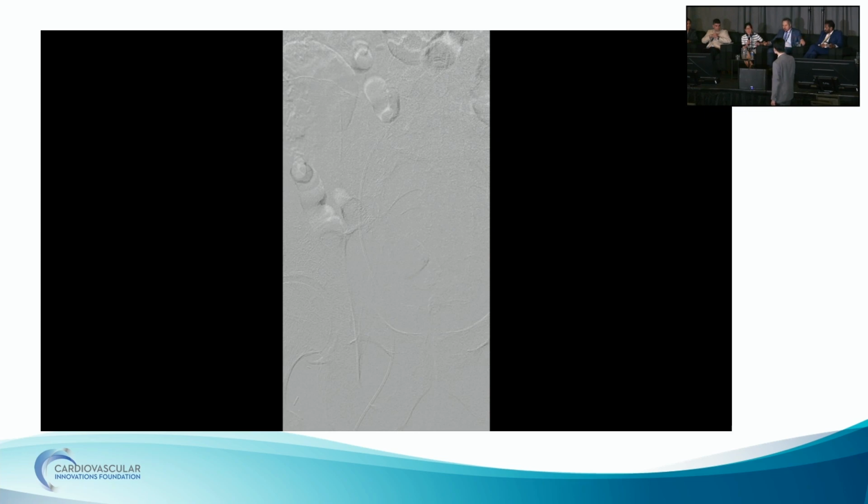Now, I did wonder how you addressed it distally. Did you just clamp it and then turn it around? Right, that's the benefit of having open access: once we established inflow, we just clamp the graft and then redirect the sheath distally. And then do you flush going down the SFA? In that case, I would have used the 7 French, or you could put a Fogarty down that way, although you never know if you're going to drag out some plaque.